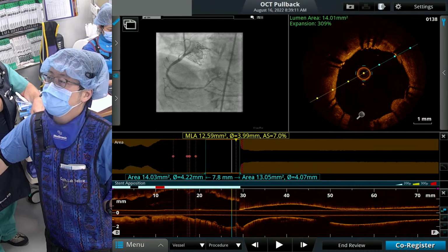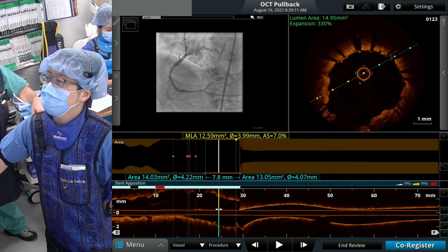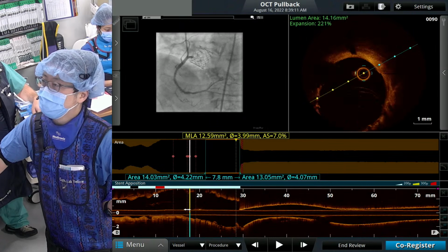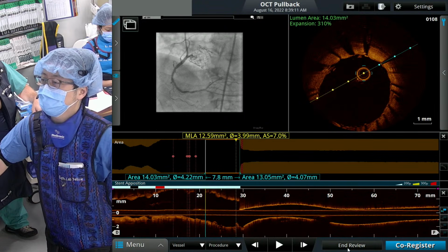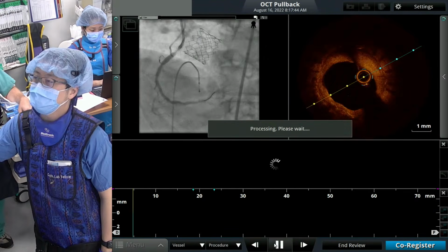Let's discuss the OCT a little more, the plaque. We can show it, maybe some kind of thrombus, to test exactly what it was. Perfect. So go back to the original, first one. That patient has been assigned to intimal hyperplasia, right? And neoatherosclerosis.